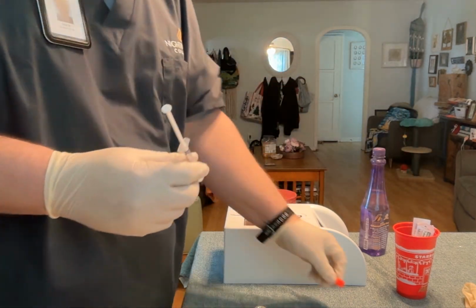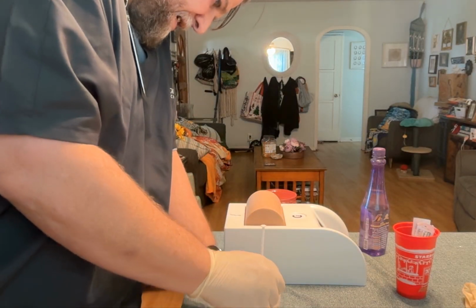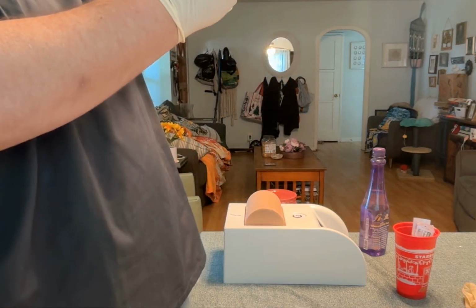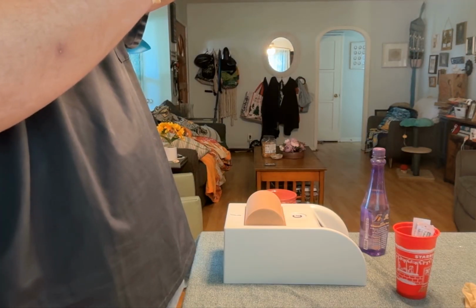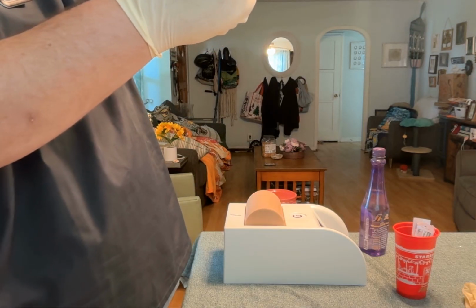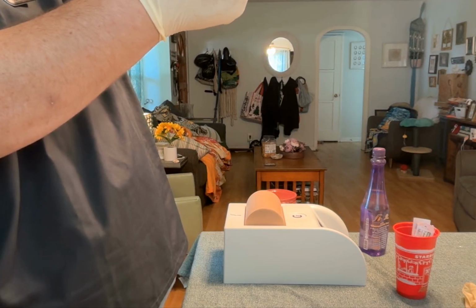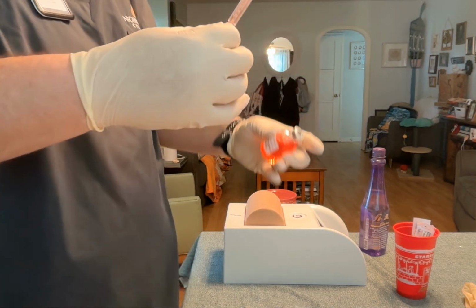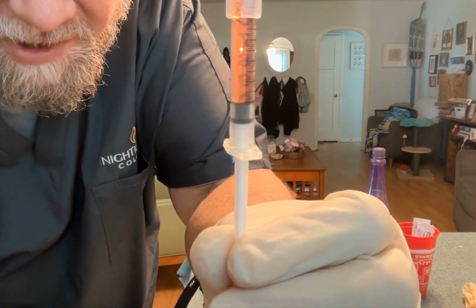Now that my medication rubber stopper is dry, I'm going to put my needle in and inject the air into the vial. I'm going to flip it over and withdraw a little bit more than 1 milliliter. See any air bubbles? I do not. I'm going to push it back up to be exactly 1 milliliter. I currently have 1 milliliter of solution.